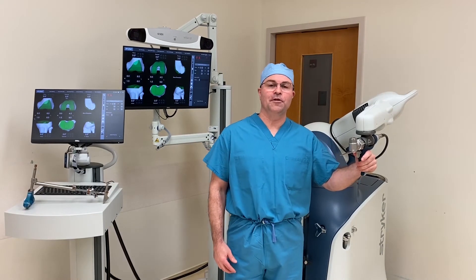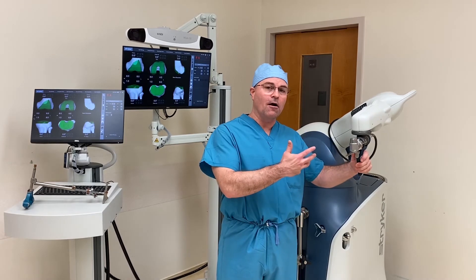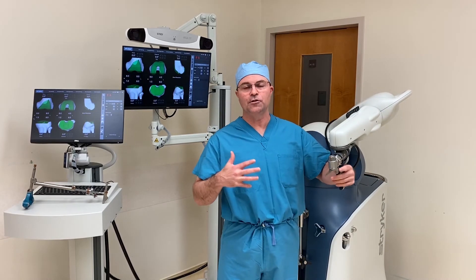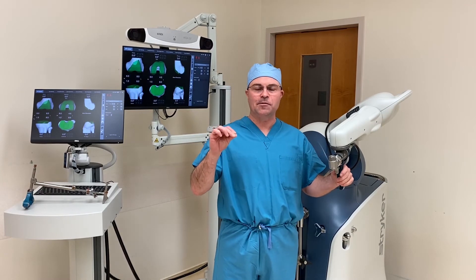The precision and reproducibility that the robot affords comes in large part from the robotic arm, which helps hold the saw and helps guide me, the surgeon, doing the procedure, to execute the procedure exactly as planned.